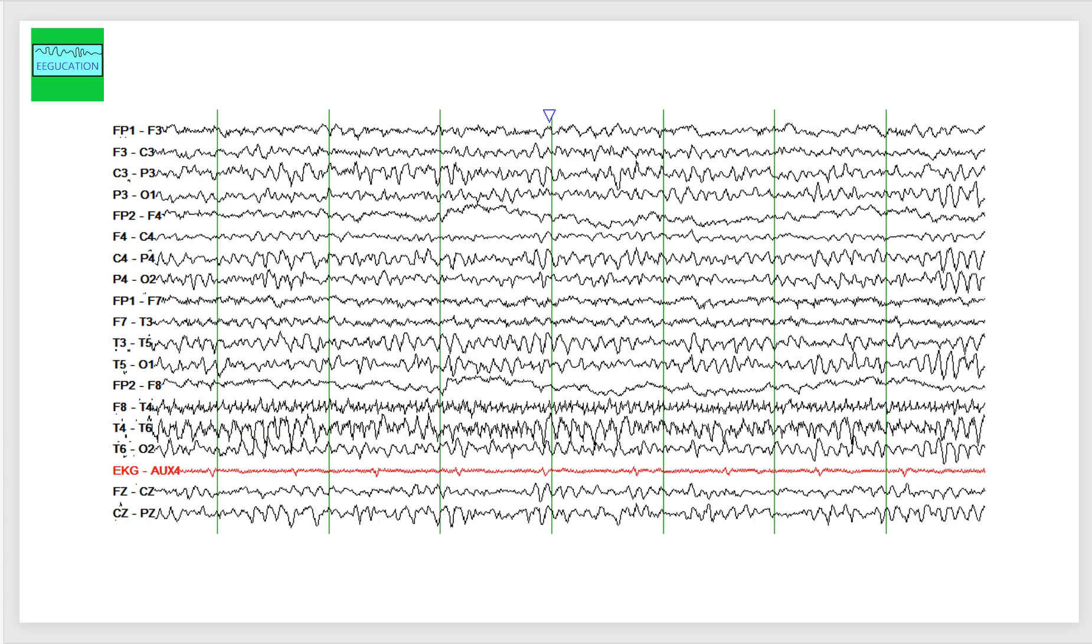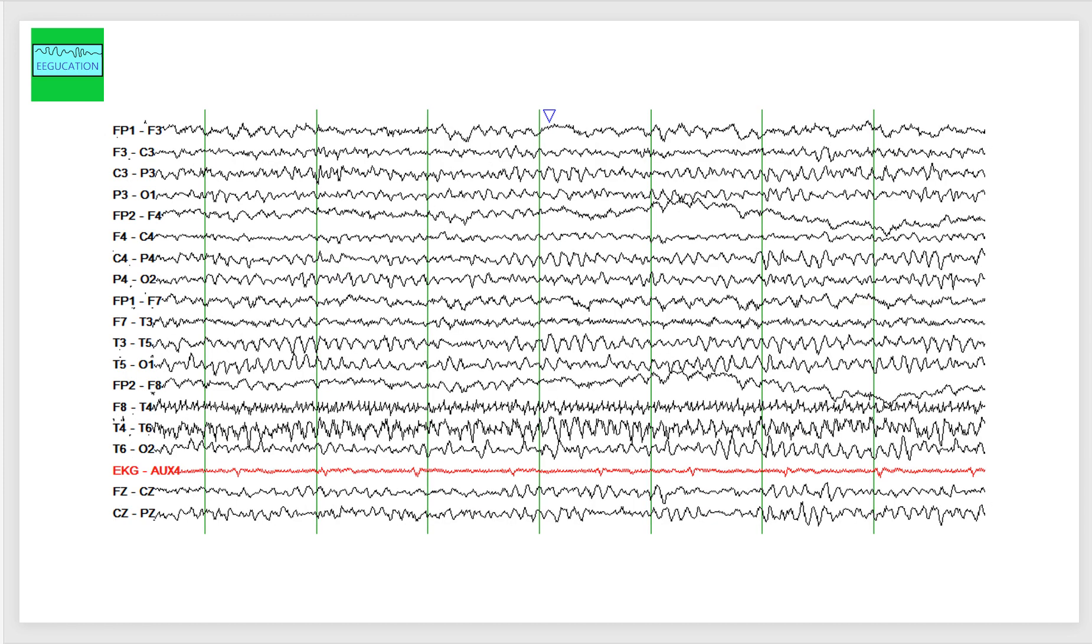This is another snapshot from the same patient, and we see higher amplitudes and faster frequencies in this right temporal head region. And this is one more snapshot from the same patient.